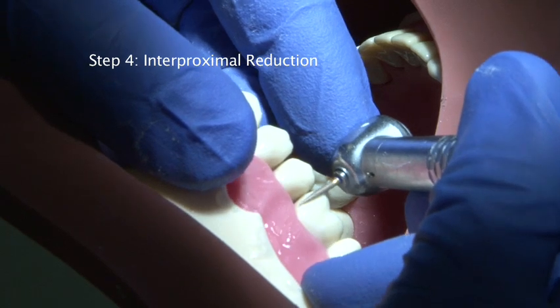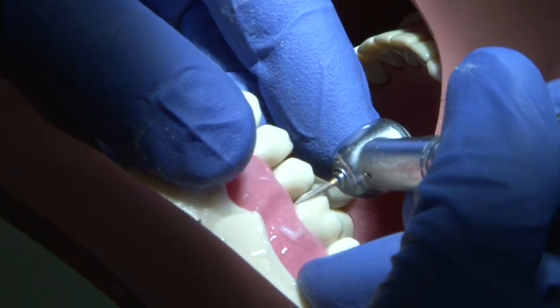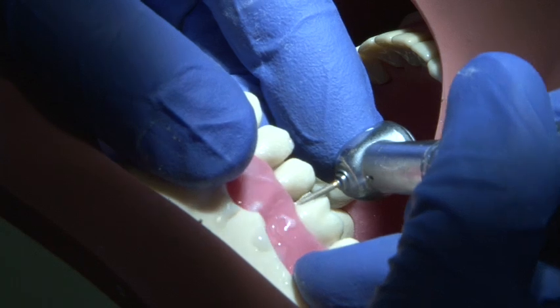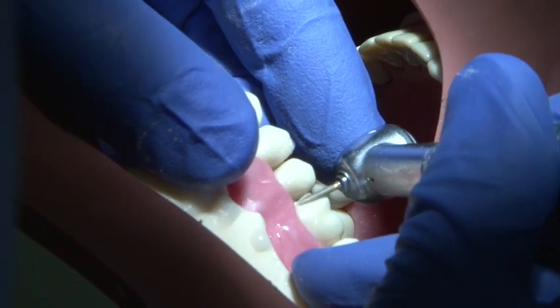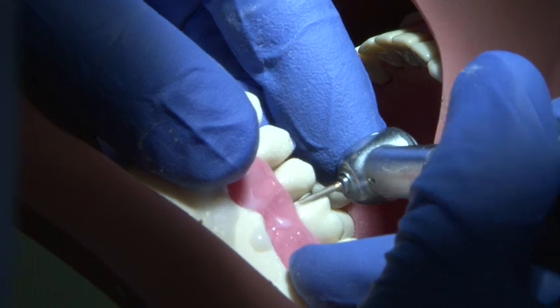Interproximal reduction is carried out using a fine pointed burr. Use a smooth continuous action and support your burr hand at all times. It's important to avoid damage to the adjacent tooth. It may be possible to use a small metal strip inserted between the teeth to protect the adjacent tooth.